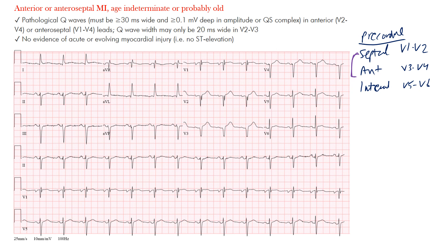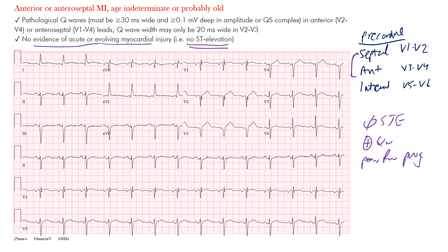For an anteroseptal MI we're looking at V1 to V4. Since this is not an acute MI, we do not want to see ST elevation. What you do want to see are pathological Q waves. You'll also likely see poor R wave progression, since the anterior portion of the left ventricle is involved. No evidence of acute or evolving MI — no ST elevation, no injury pattern.